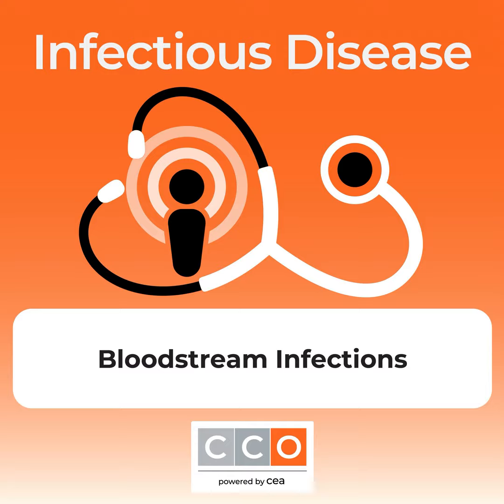So, the advent of rapid diagnostic tests for bloodstream infections can really supplement our traditional culture and susceptibility testing methods and allow us earlier optimization of our antibiotic therapy by providing early species identification and also, in some situations, even identifying the presence or absence of specific resistance genes. There are even some technologies that can provide early preliminary susceptibility results. These rapid diagnostic testing methodologies are recommended by the American Society for Microbiology to reduce the time to targeted therapy in patients with positive cultures when utilized in combination with active communication of the test results.